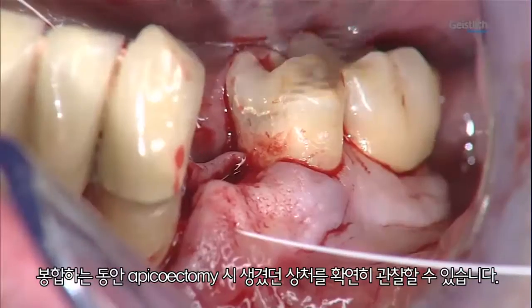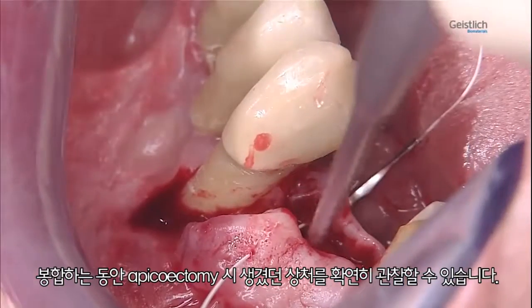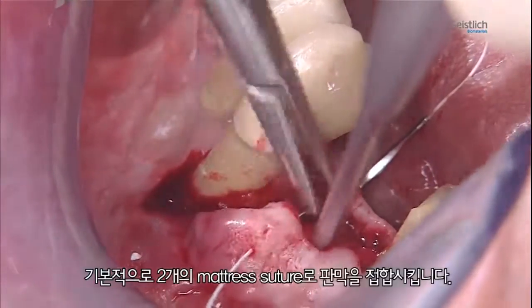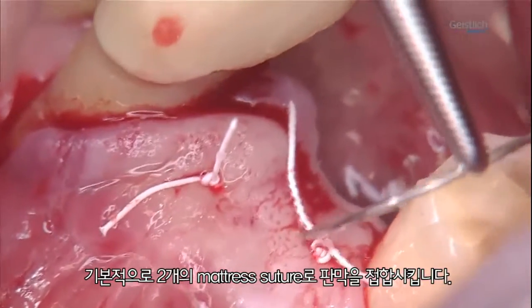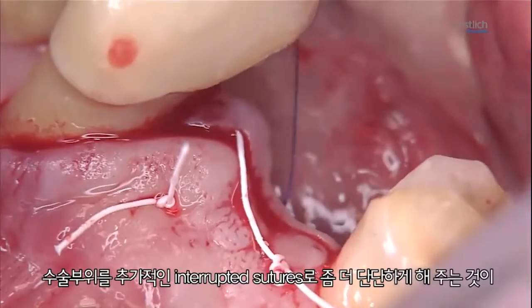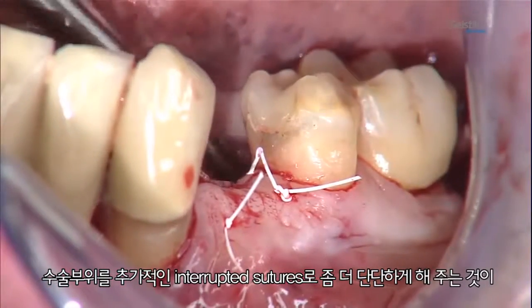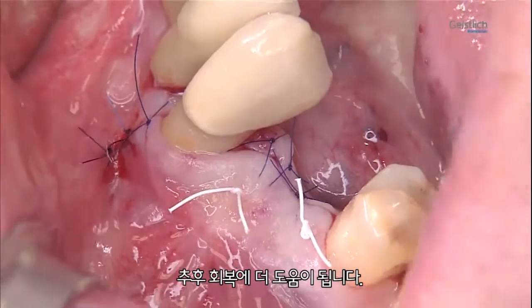During suturing, we can clearly see the vestibular scar created during the original root resection. The surgical access is initially closed for adaptation of the flap edges with two crestal mattress sutures. For further healing, it is advantageous if the surgical area is tightly sealed with additional interrupted sutures.